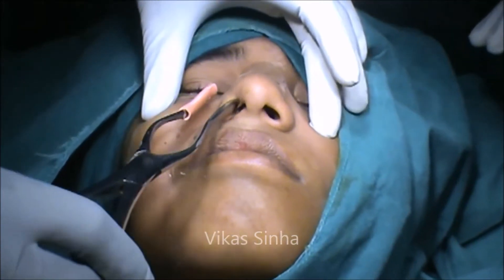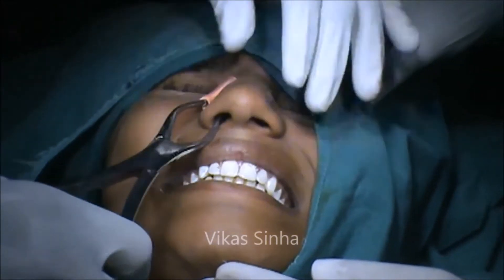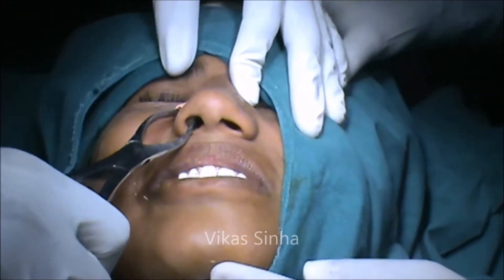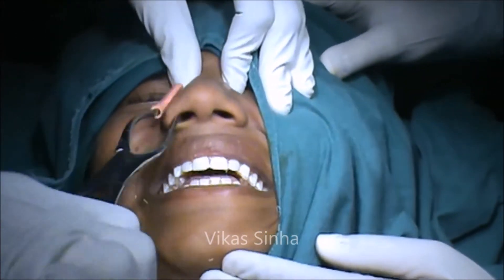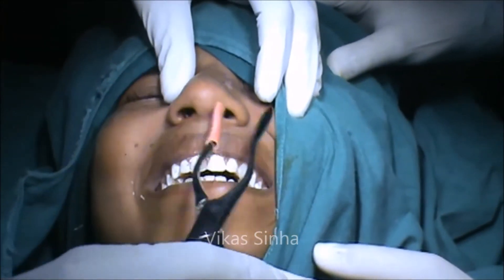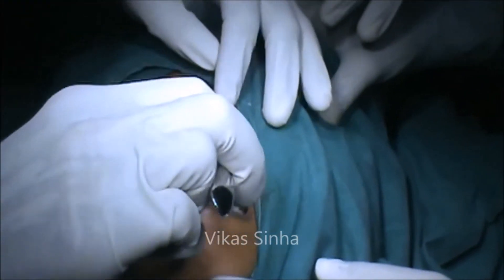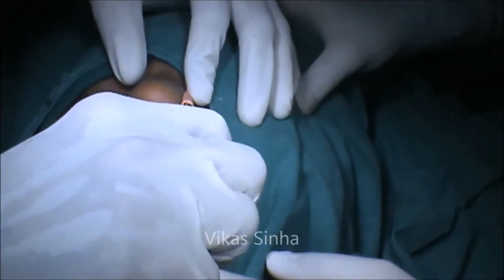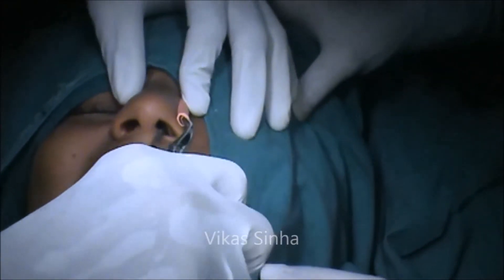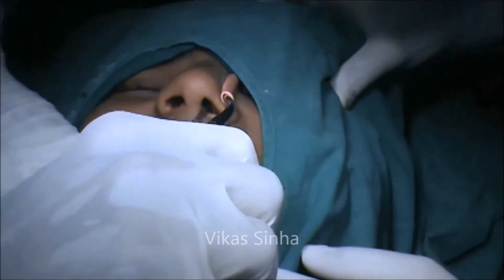Now with the help of Walsham forceps, first I will disimpact the fracture. I will turn the Walsham forceps, disimpacting it. On the other side also, I will disimpact it.